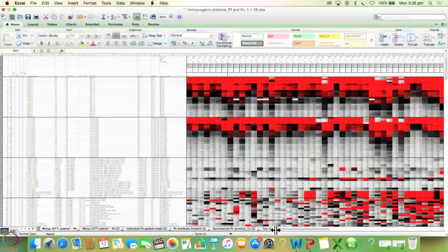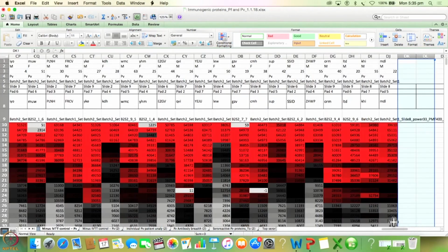To get this whole list of best seroreactive proteins, you can also do this on Excel using a particular formula, which I will show you now. So let's go back to the Excel. This is how our Excel was before we removed all of these rows which are IgG and anti-human IgG. I've retained them for now. I'll probably zoom this a little bit.